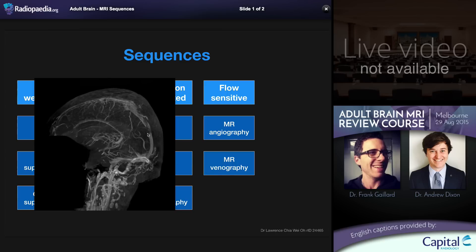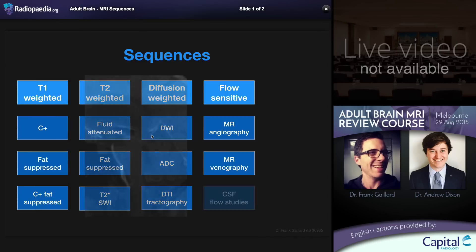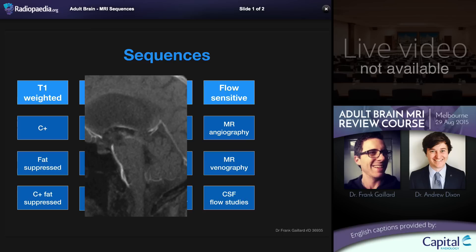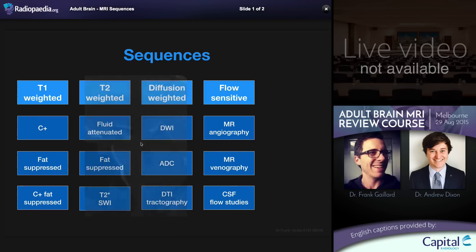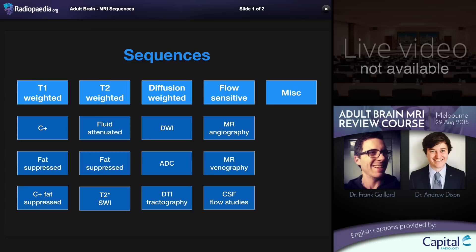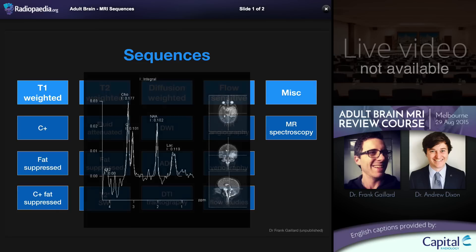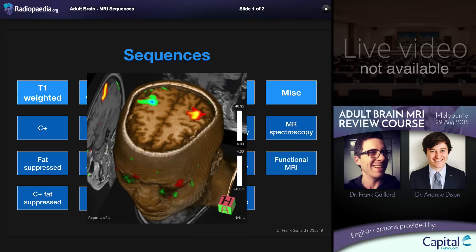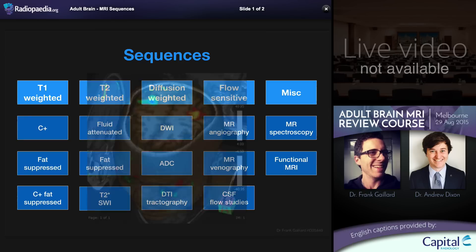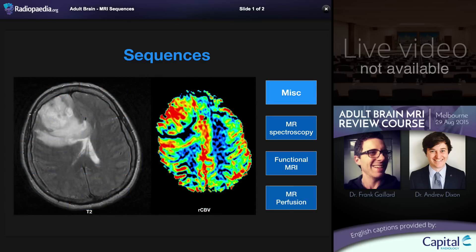Here we can see thrombosis or occlusion of the posterior part of the superior sagittal sinus. The same phase contrast principles can be employed to look at pulsatile flow of CSF in the cisterns and aqueduct, which can be particularly useful if aqueduct stenosis needs to be excluded or if hyperdynamic flow of normal pressure hydrocephalus needs to be evaluated. Moving to the last column of miscellaneous sequences: MR spectroscopy is performed very routinely as part of brain tumor or mass workup. Functional MRI allows imaging of specific parts of the brain being activated during motor, verbal, or memory tasks.